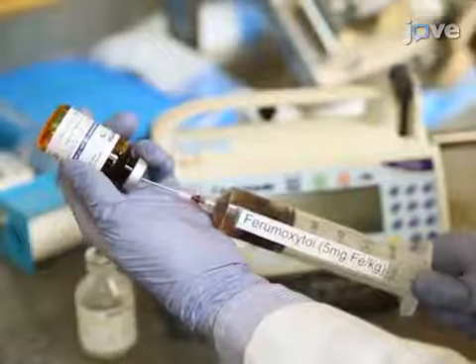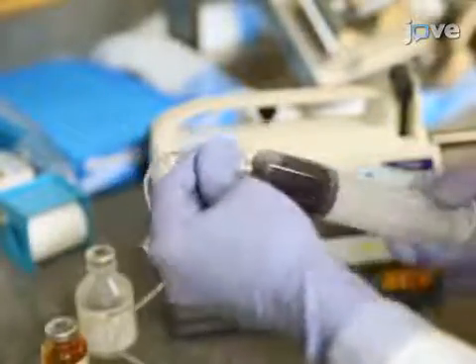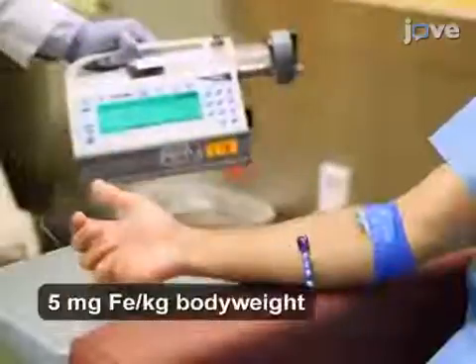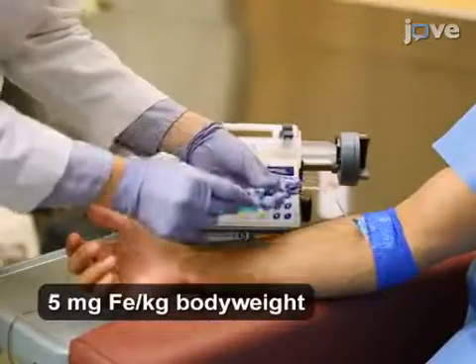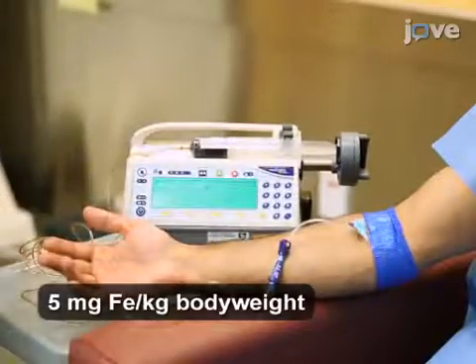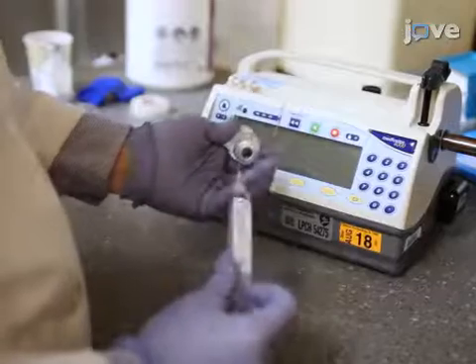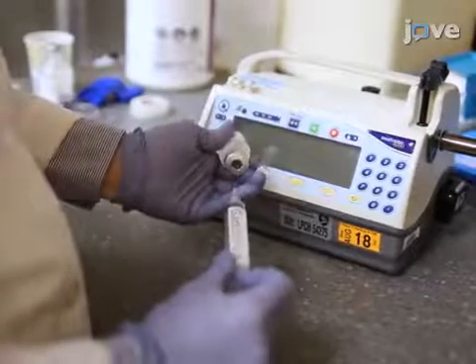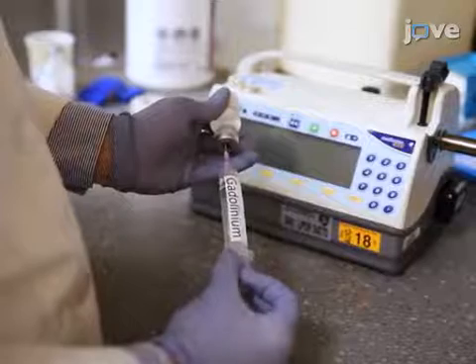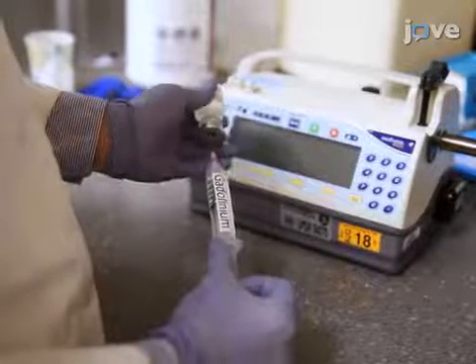1 to 2 hours before the scan, infuse ferromoxetil diluted in saline at a 1:4 ratio intravenously into the patient over at least 15 minutes, according to FDA protocols. Alternatively, standard gadolinium-based contrast agent can be administered directly before the start of the PET-MRI scan — that is, after the localizers and directly before starting the integrated PET-MRI scan.